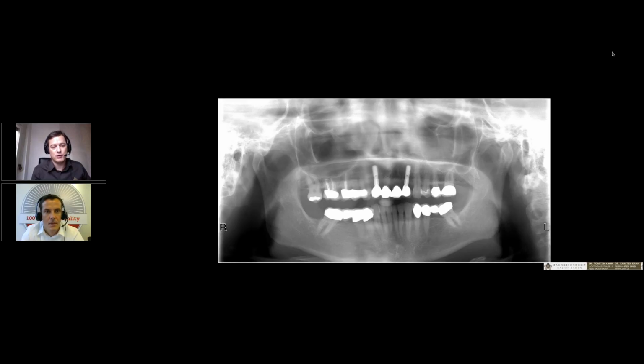If you have a very big bone loss and a very big infection, sometimes you have to make a ring augmentation from Giesenhagen, or a block augmentation. But in the rest of the cases, you can do it with a tunnel technique without using vertical incisions. So don't make vertical incisions. You can make a very big, huge augmentation in all cases without these old techniques.